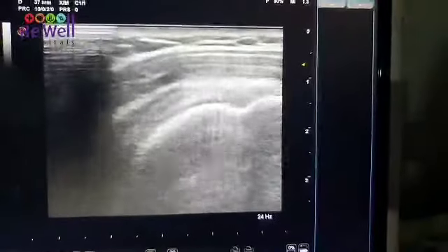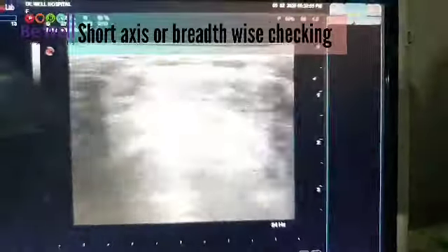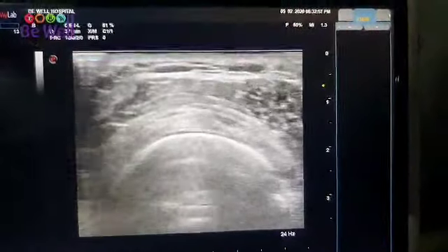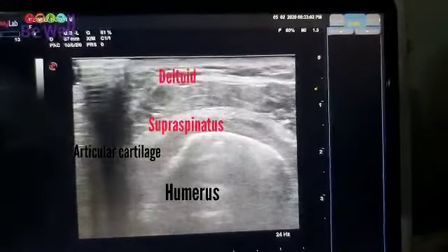Now checking the short axis of the supraspinatus. This is the short axis of the supraspinatus. I can see that there are no tears.